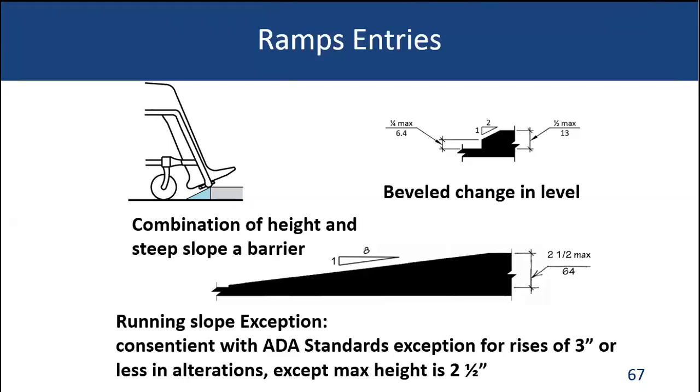And the analysis is that this was acceptable in the case where these weight scales have very short platform heights. But the 1 to 8 is the steepest you would ever want to go. Otherwise, you could have something happen like this image shown here in the upper left-hand corner of the slide, where a combination of the platform height and the steep slope will cause your footrest to jam, and you would never get your wheels up onto the slope.